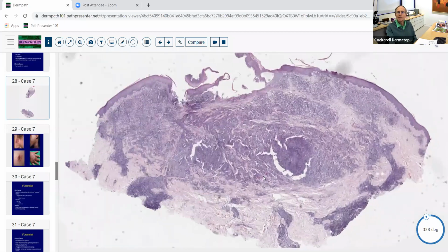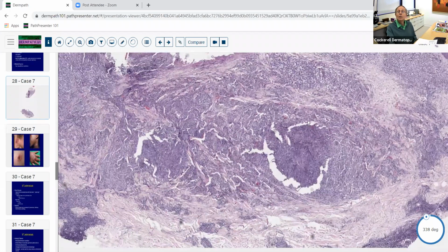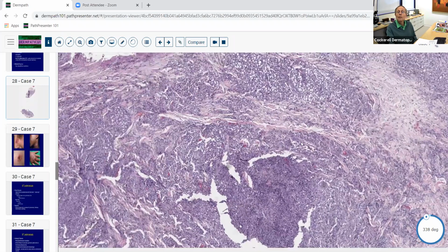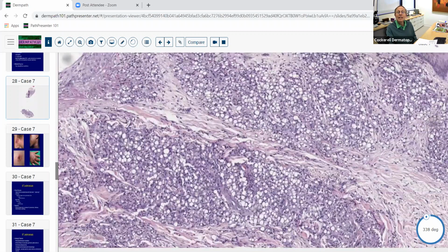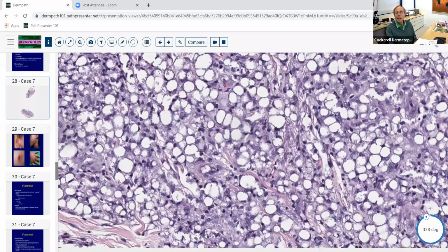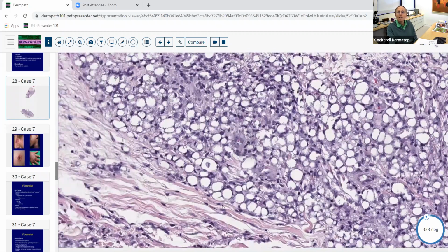So we're going to go to higher magnification. Once again, we see lots of histiocytes in a diffuse pattern. We should think about the possibility of an infectious disease. And as we get to this power, we can start seeing that there are these cells that contain these little holes in them again, clear with these little teensy tiny organisms that are clustering at the periphery of these histiocytes. These histiocytes have been parasitized by these organisms. And notice that they're clustering at the periphery. That's what we refer to as the marquee sign or the Ferris wheel sign.